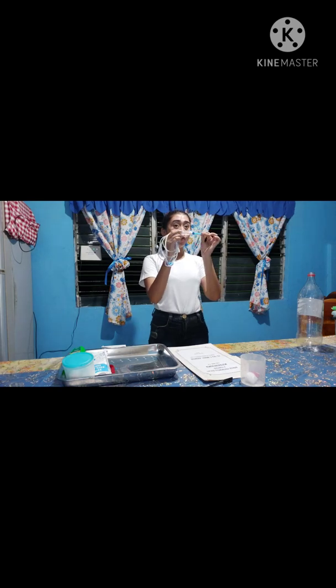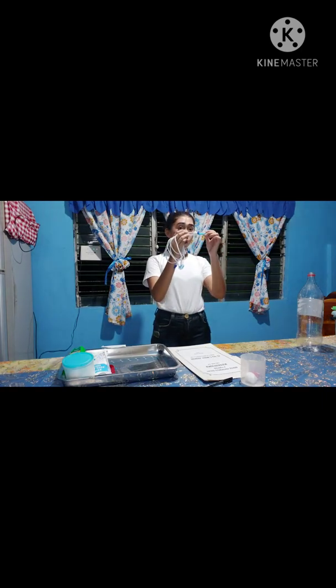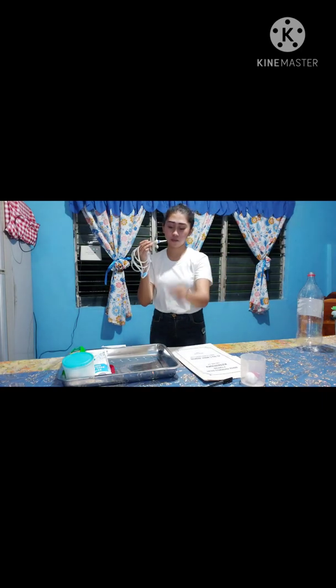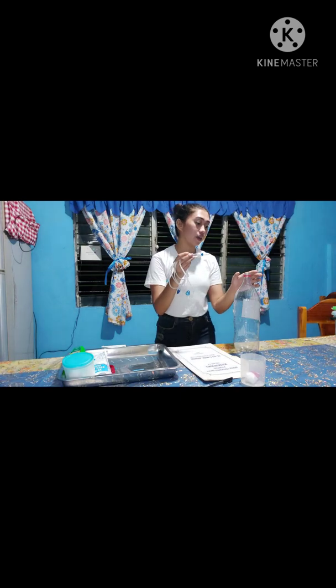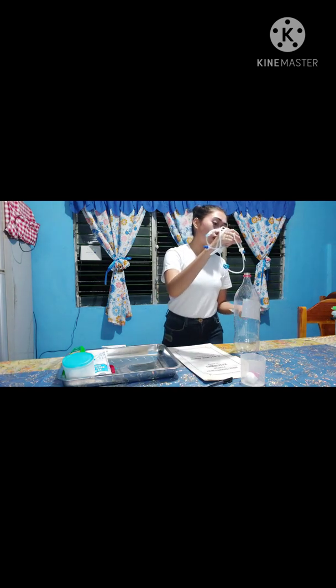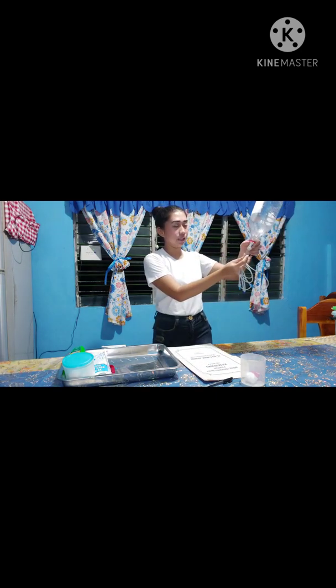Then the next step is to remove the protective cap of the IV set puncture device, and then we're going to insert it into the rubber port of the solution bottle to start priming the solution. So we're now going to remove it. This is the protective cap of the IV. And then we're going to put it on the rubberized part of the solution. Let's assume that this is the rubberized part of the solution. So we're going to put it there. And then after that, we're going to invert it and release.